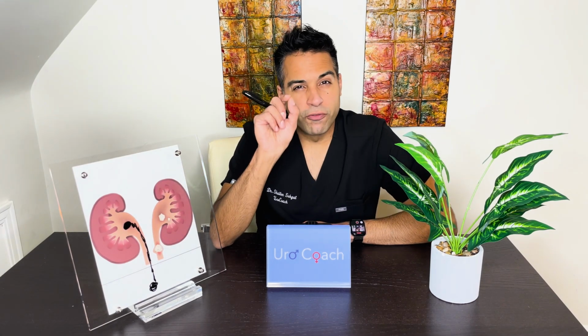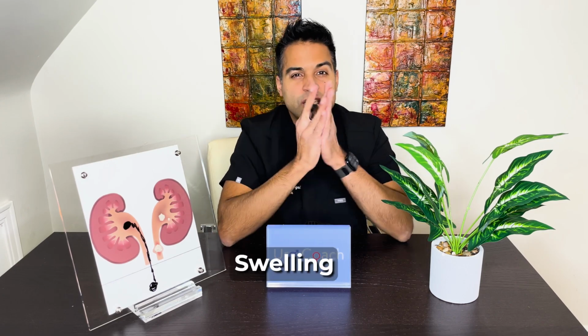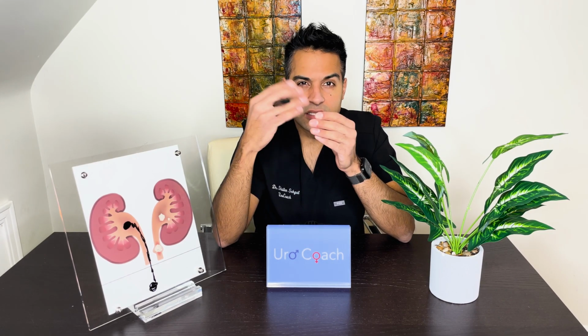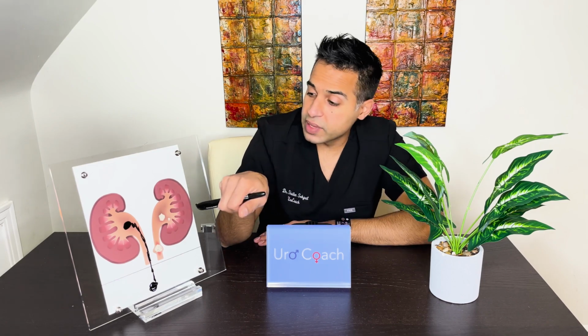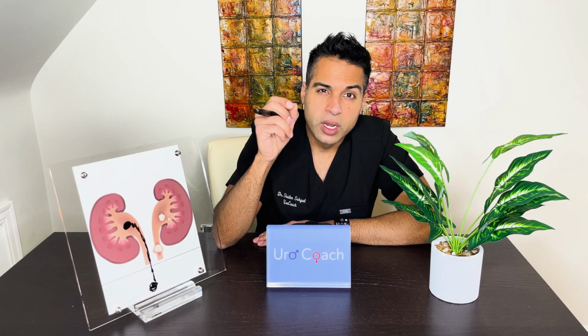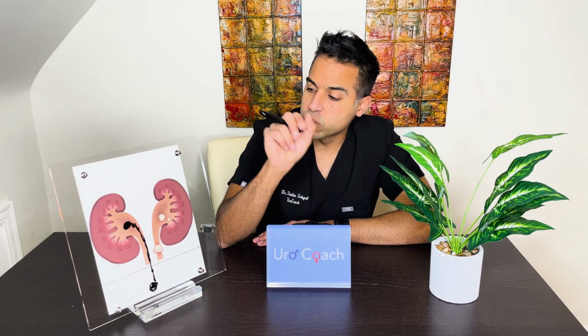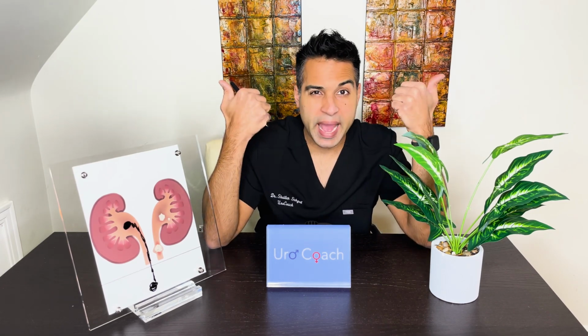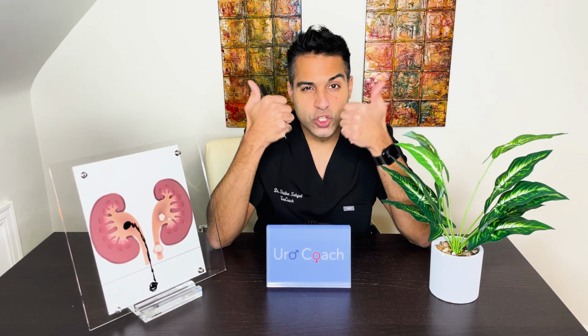But whenever we put a foreign body anywhere in the urinary tract, it can get swelling. If you get a scratch on your arm, you're going to get swelling there. It's going to be inflamed. It may look bigger as it heals before it kind of gets smaller. The same thing happens in the ureter. When you put a foreign body, that scope, into the ureter, and that acute period afterwards, it's going to swell some. When it swells some, we don't want it to swell so much that it closes off the flow of urine. So if that happens, urine's going to back up behind the swelling, and it's going to feel like the exact same pain with a stone.